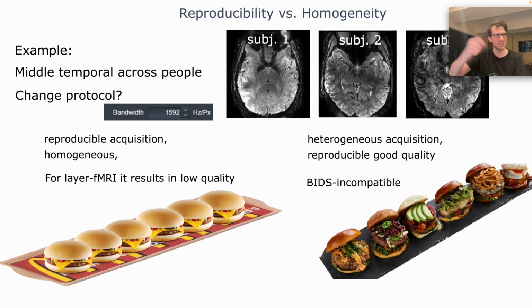It makes you more sensitive to shimming or less sensitive, but as soon as you change it, very often it also changes echo time, which I think is still fine, but then it changes TR. Is that still fine? Everybody needs to find their compromise there. But it is one degree of freedom that you need to play with when you optimize your protocol for your neuroscientific paradigm.